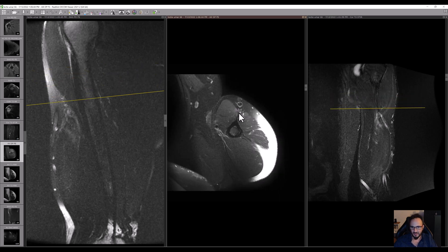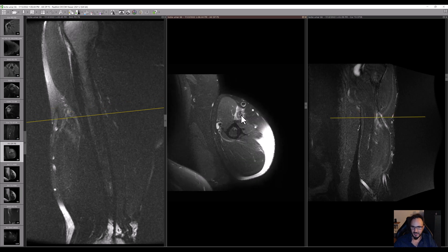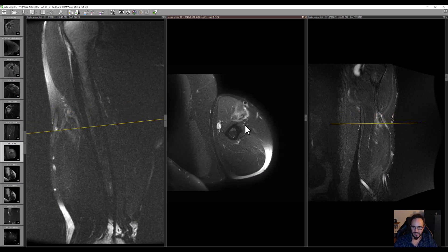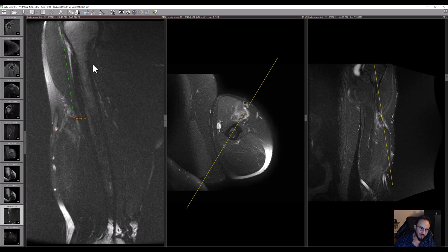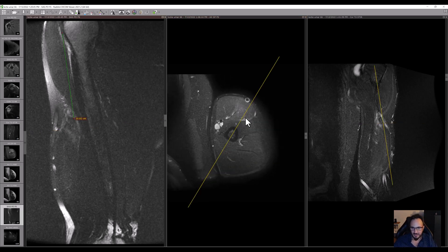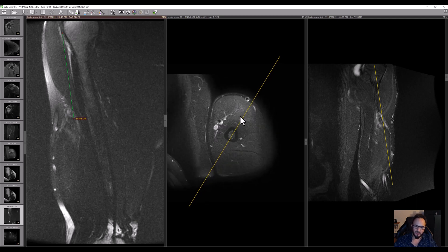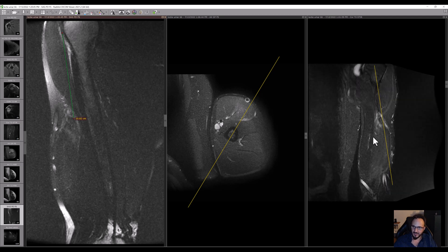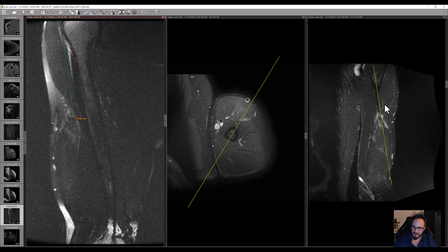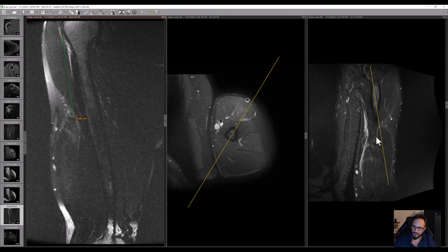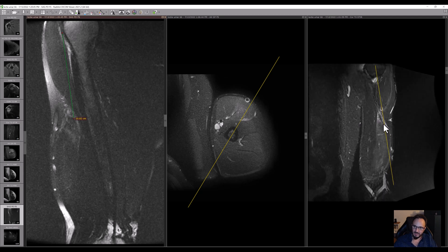Now something is appearing here — this is the tendon, which is enlarged and retracted around 10 cm. This is the muscle. This is the coronal view of the same patient.